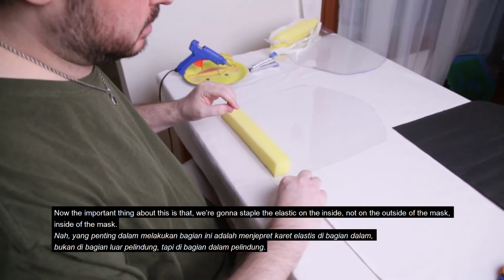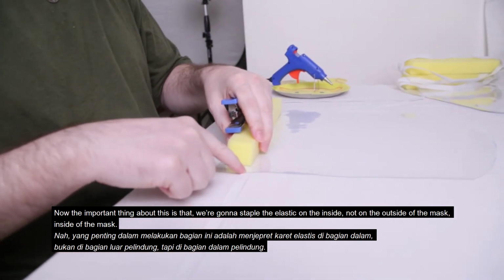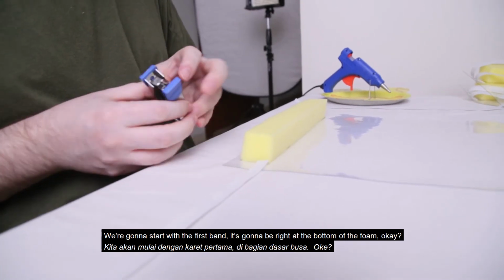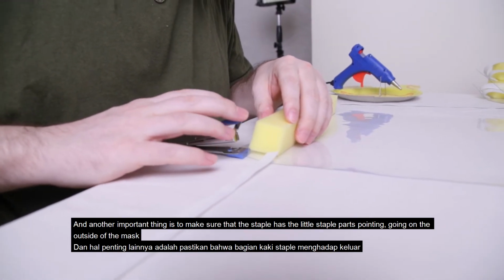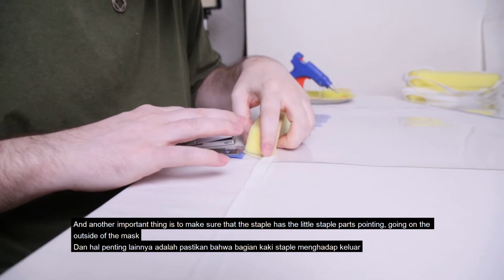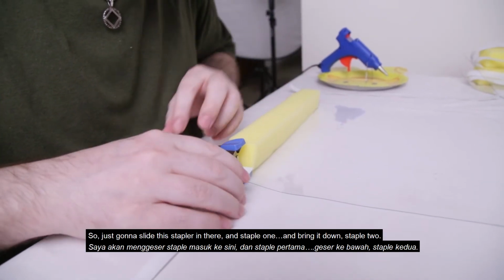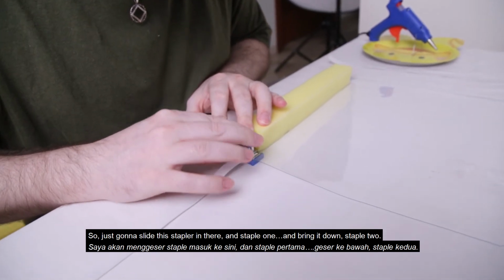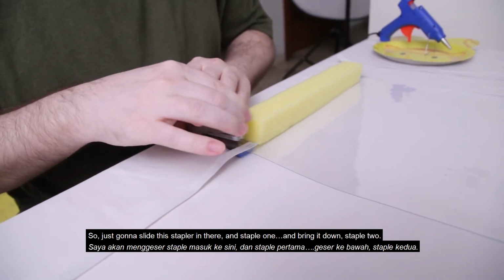Now the important thing on this is that we're going to staple the elastic on the inside of the mask, not on the outside. We're going to start with the first band right at the bottom of the foam. Okay. And another important thing is to make sure that the staple has the little staple parts going on the outside of the mask, because you don't want it snagging on anyone's hair or the nurse's hair nets or anything like that. So just going to slide the stapler in there and staple one, and then bring it down, staple 2.